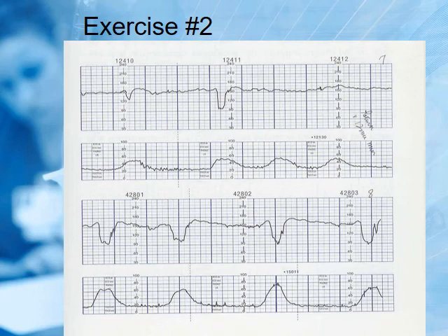All right, I'm going to do peak to peak. There's a peak, and here's a peak, and here's a peak, and here's a peak. So I'm going to say this is 1, 2, almost 3 minutes, 2.5, 1, 2 minutes, 1, 2 minutes. So about 2 minutes, 2 to 3 minutes, 2 to 2.5. Okay? Did you get the same thing if you did beginning to beginning? You should. How long are these lasting?